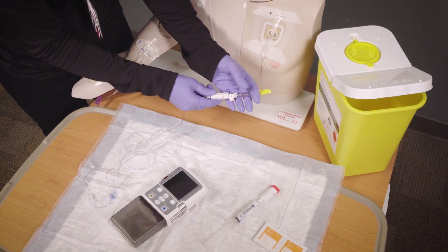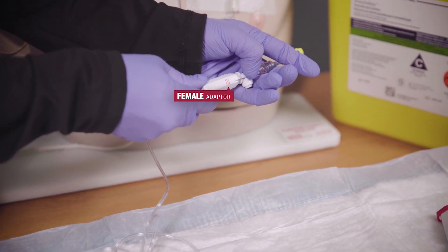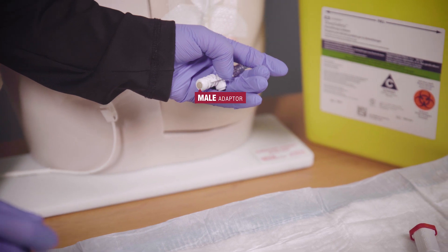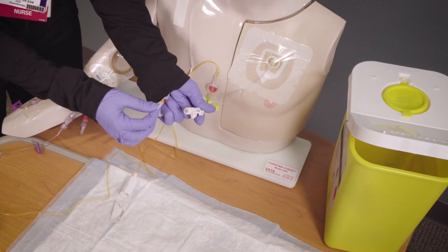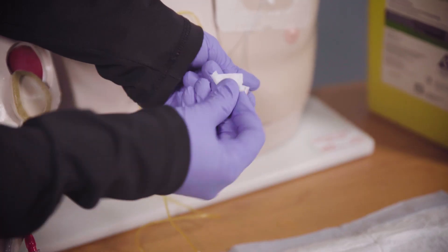Next, disconnect the tubing from the male closed system transfer device adapter by pressing in the tab with red lines on the male adapter and pulling straight out. Do not allow the male adapter end that is still attached to your central line to touch anything. If it does happen to touch anything, use an alcohol swab to scrub the end of the male adapter for 15 seconds.